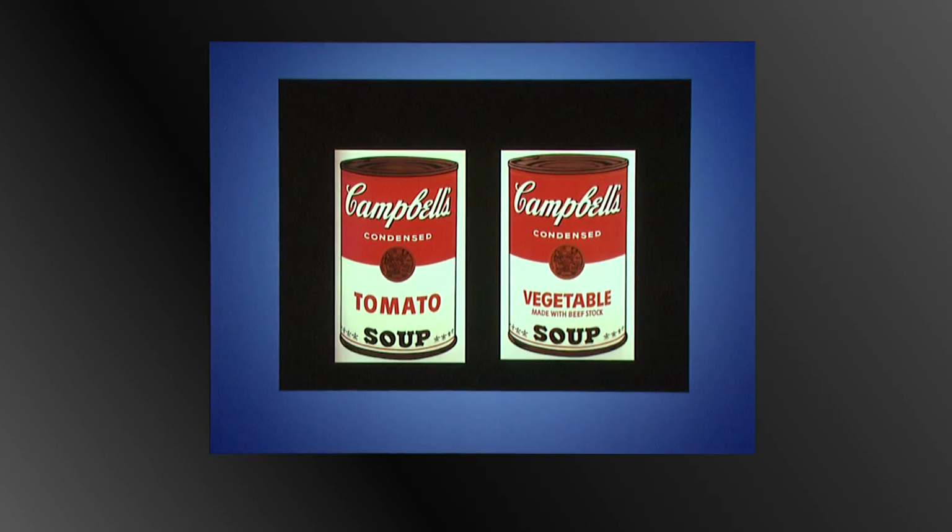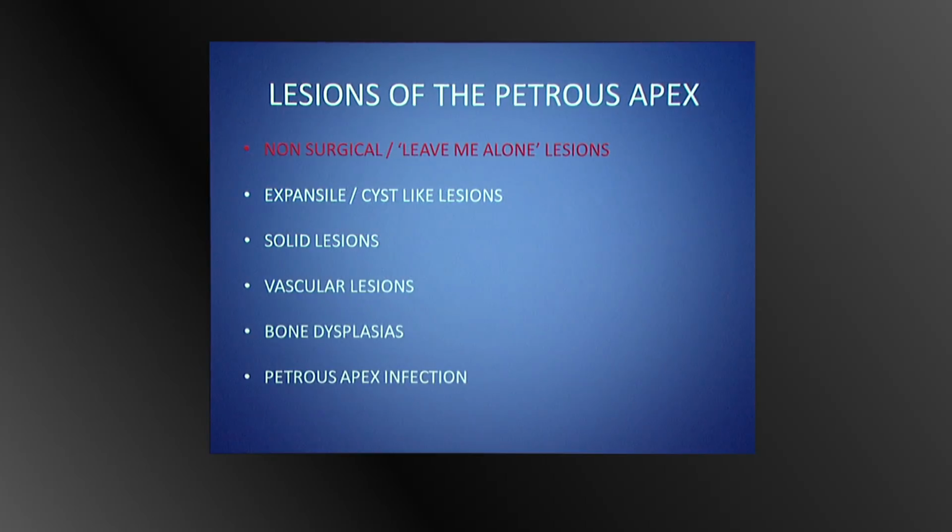The problem is, and I'll show this in my sinus talk, that completely different entities can look virtually identical. So as radiologists, really what we're looking for is subtleties, and that's what I want to show in the talk, the subtleties on how to differentiate the different entities.